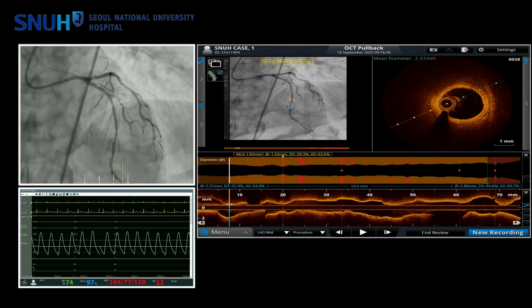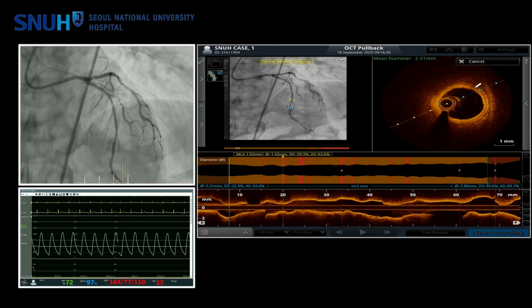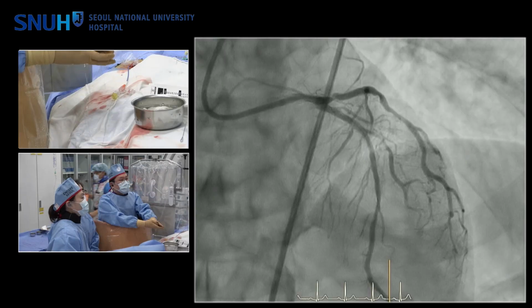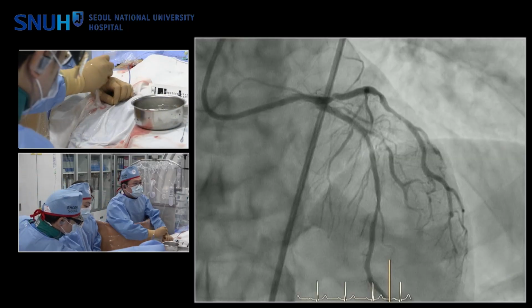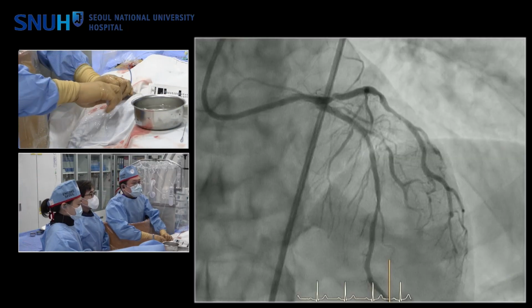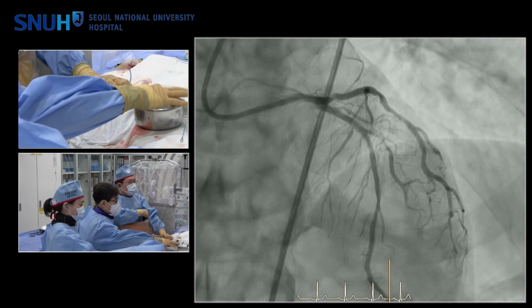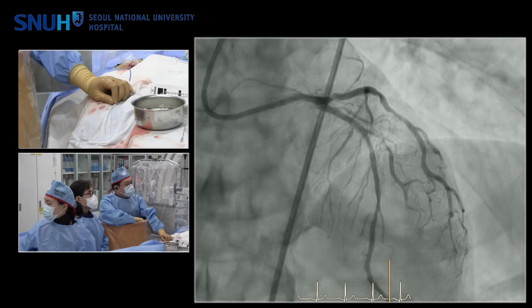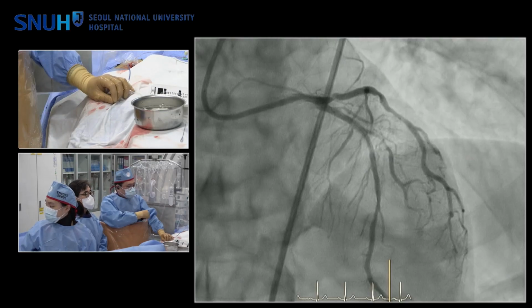Okay, actually, you remember the Rollercoaster EPIC trial that compared excimer laser, IVL, and rotablation. The IVL is comparable to rotablation. The difference is that dilatation failure is more frequently noted in rotablation. Device crossing failure is more often noted in the IVL. So in this lesion, since IVL is completed, we expect a very nice stent expansion.